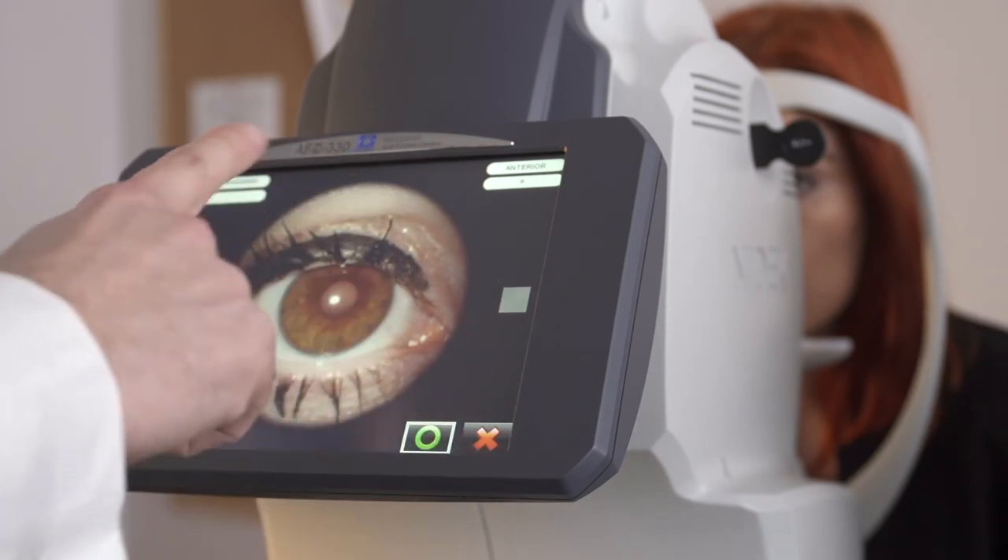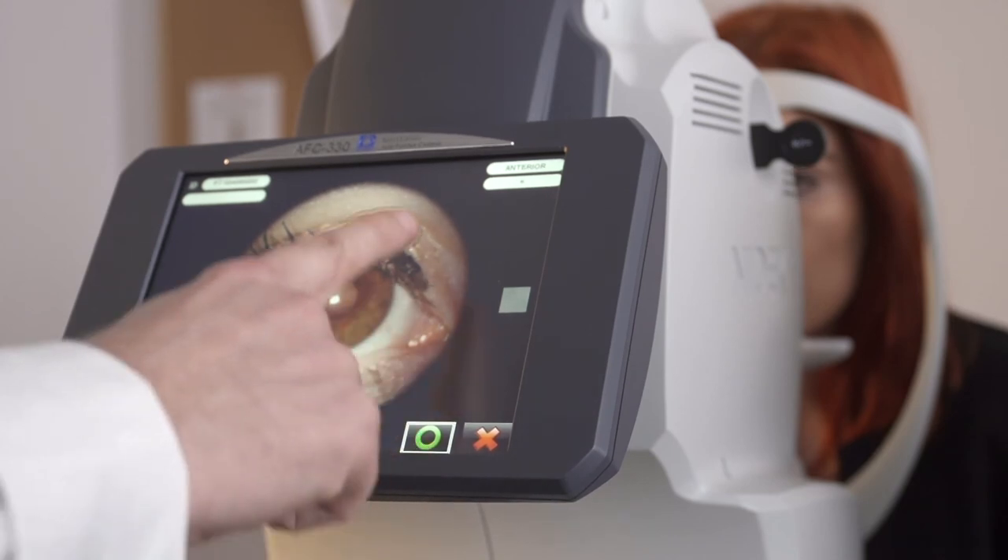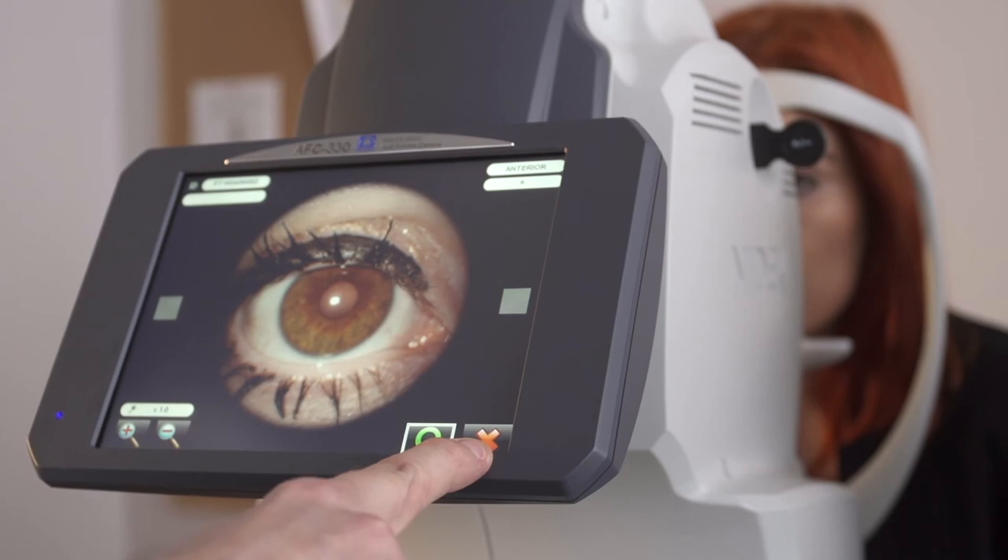At this point if we're happy with the photo we would press the green circle. If we wish to retake it we just press the red X.